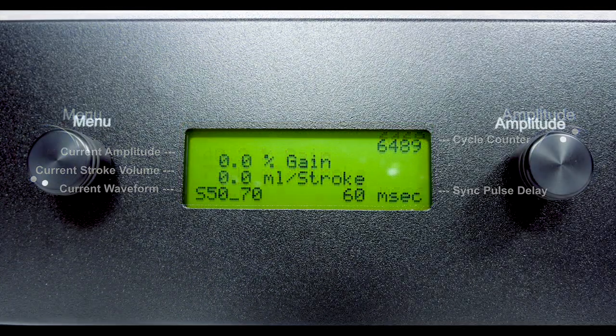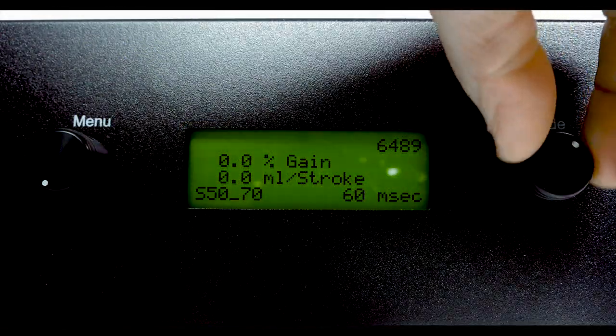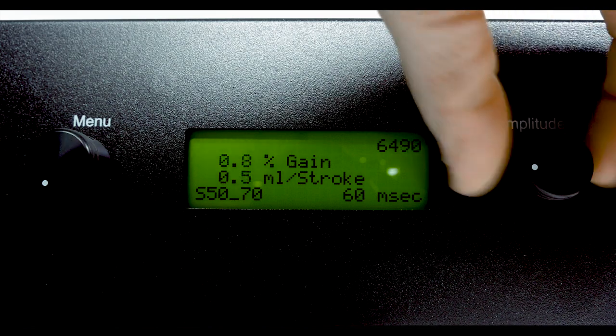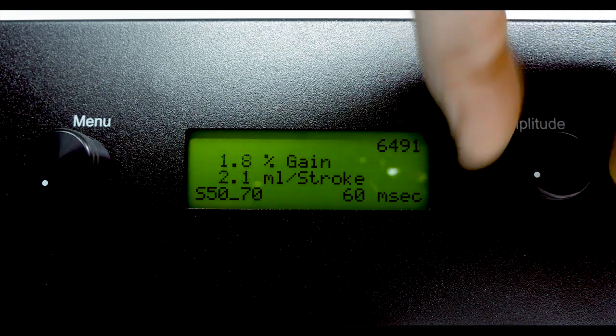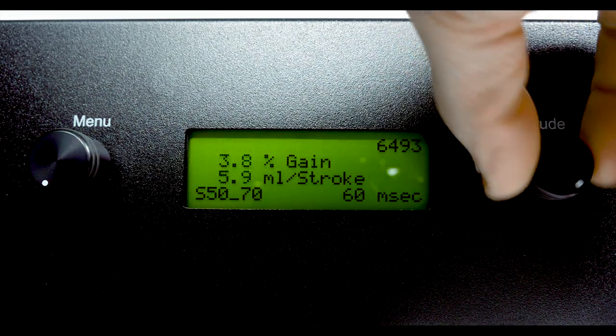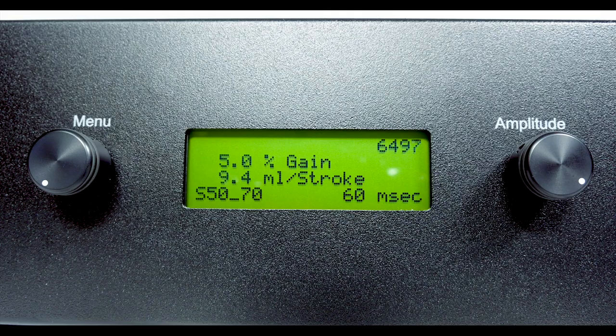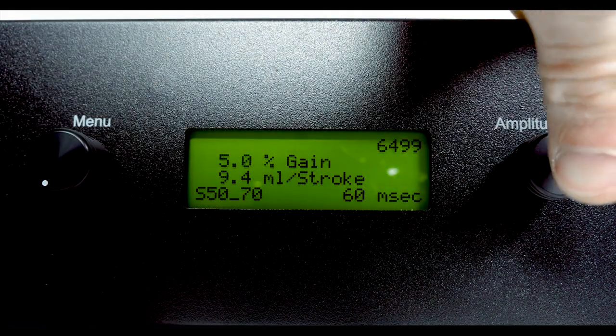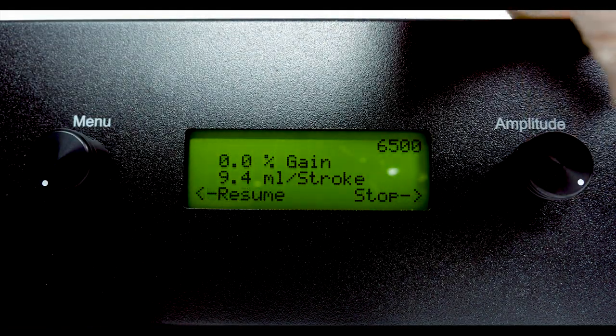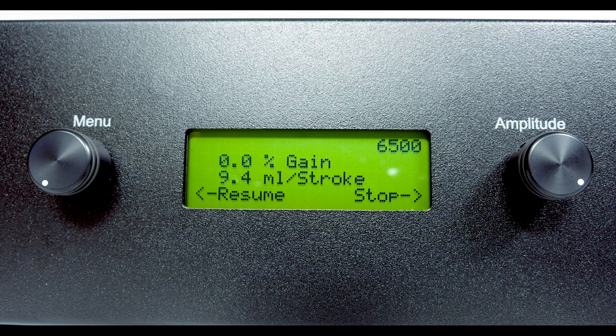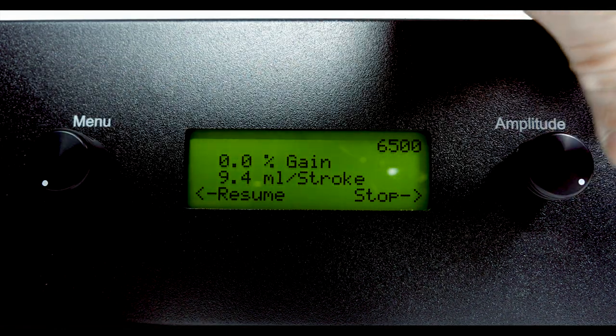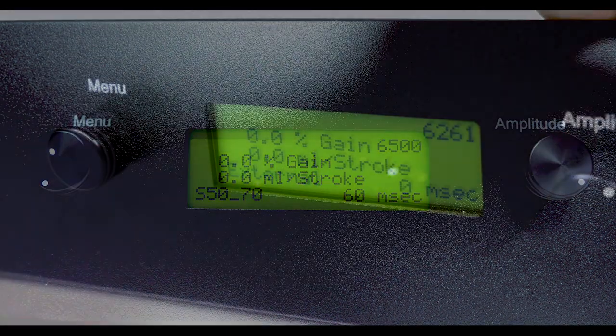The amplitude dial is used to adjust the pump stroke volume or pause the pump. Once paused, the operator can stop and home the pump or resume operation.